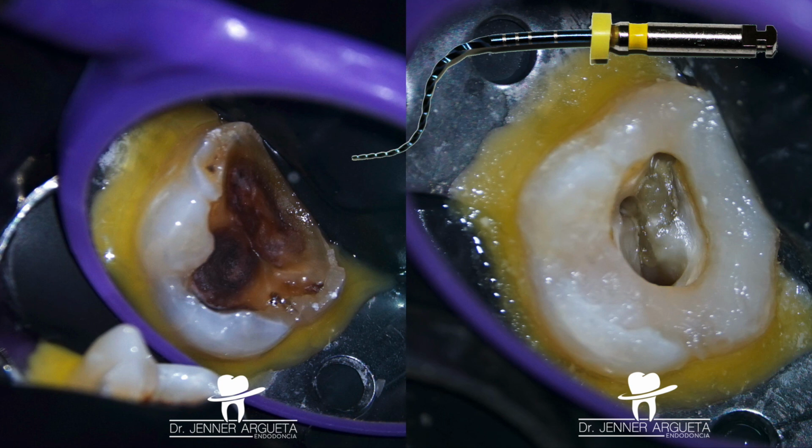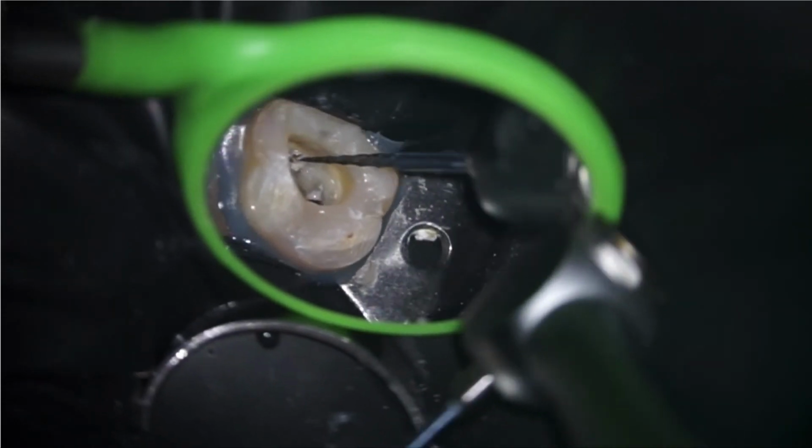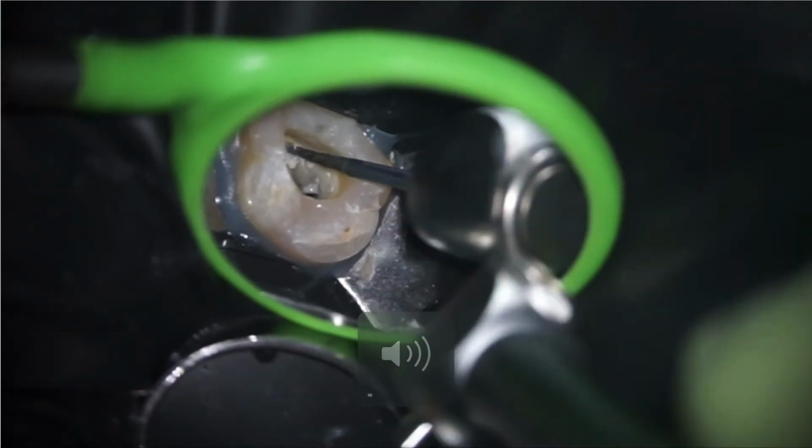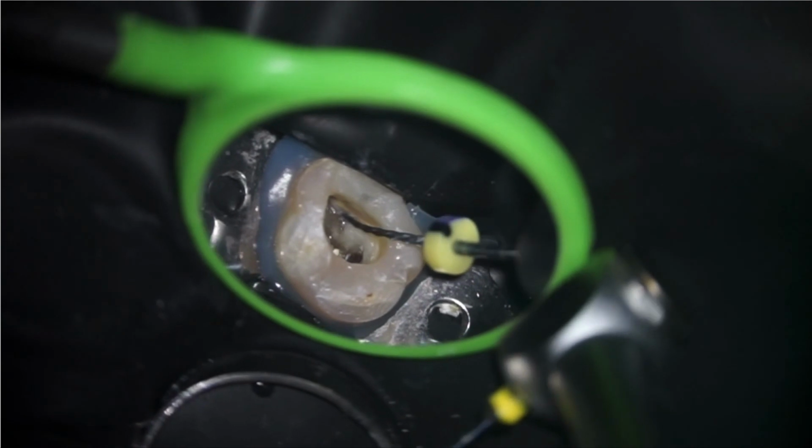It's very easy to see that we have the 3 entrances of the main canals. We can see where the MB2 might be located. So we proceed to enlarge, to shape, and to clean the MB2. For doing this, I use the Aurum Blue system. Aurum Blue is a file system by Meta Biomed as well.